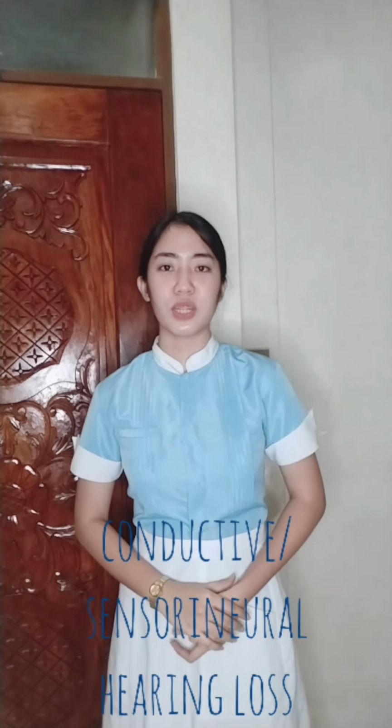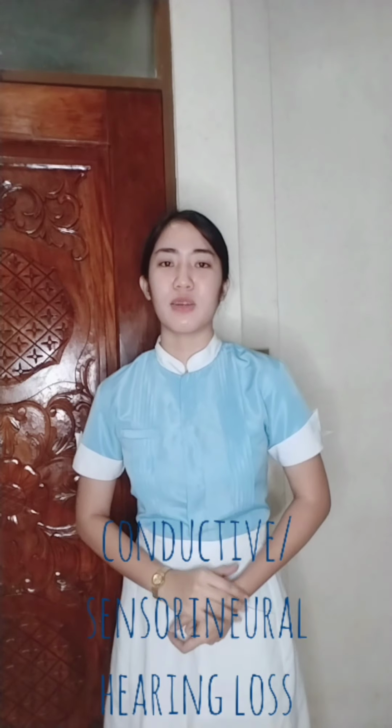Rinne and Weber's tests are exams that test for hearing loss. They help determine whether you may have a conductive or sensorineural hearing loss, and this determination allows a doctor to come up with a treatment plan for hearing changes.